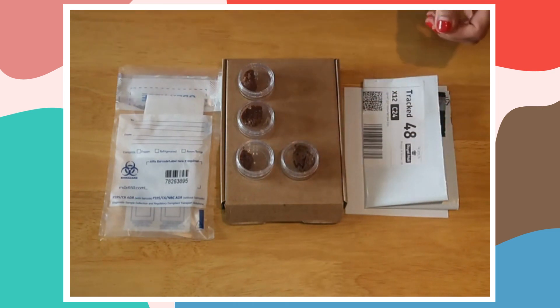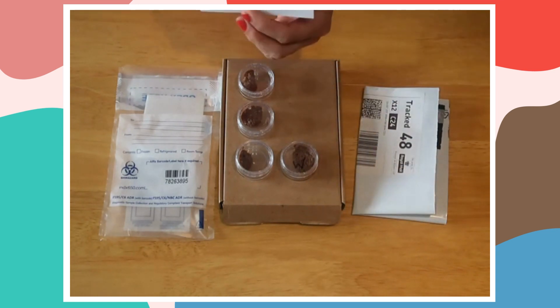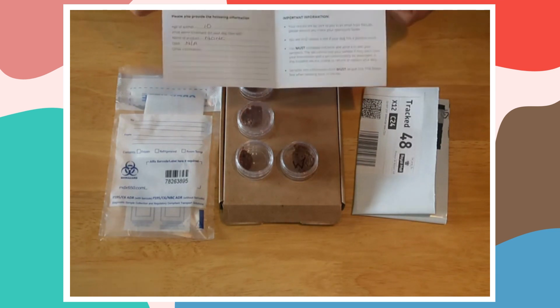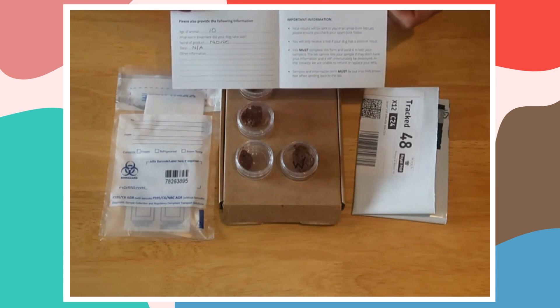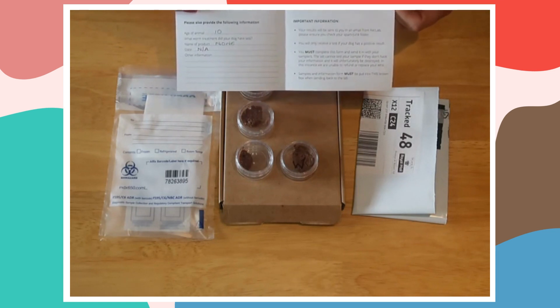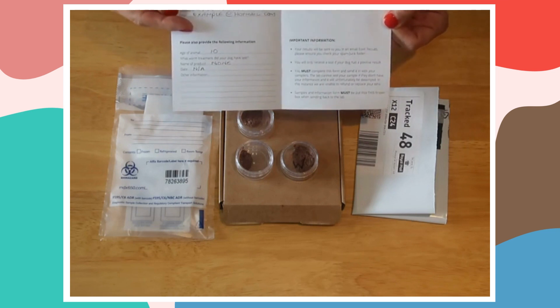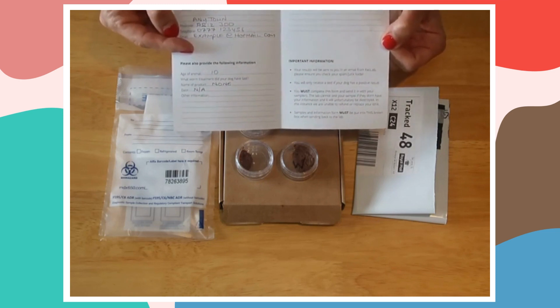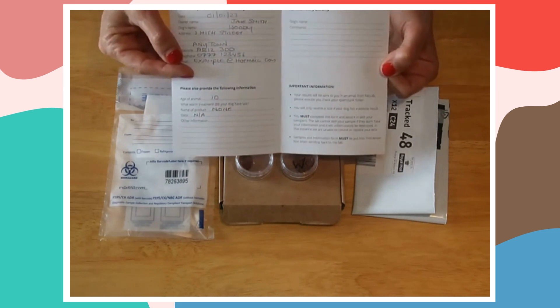Now you've got your four samples. What we need you to do next — and this is very important — is fill in the date, your name, the name of your dog, your address, your telephone number and your email address. Your telephone number, email address, your name and your dog's name are crucial, because without that we can't give you any information — we won't know which dog it belongs to or who you are.